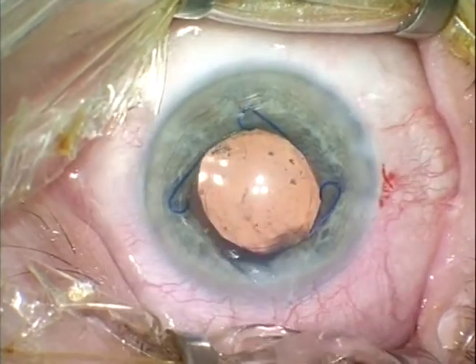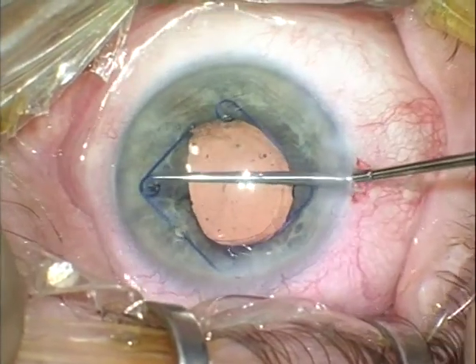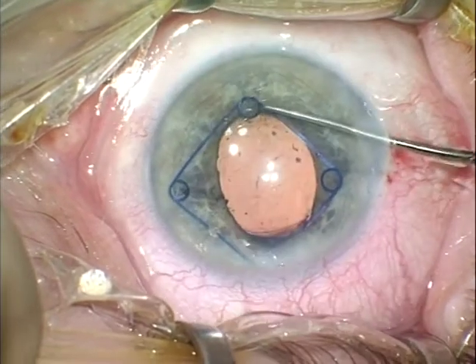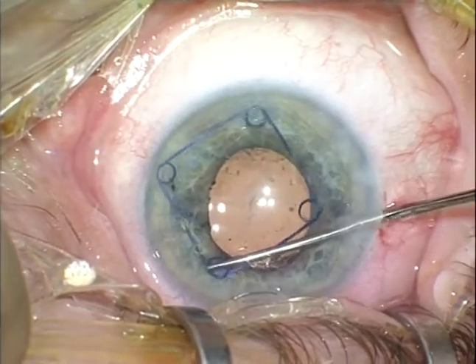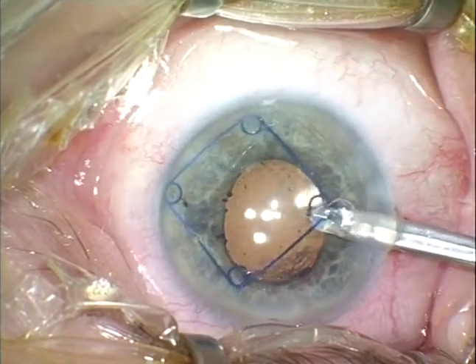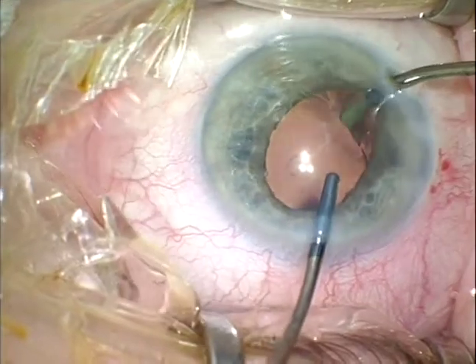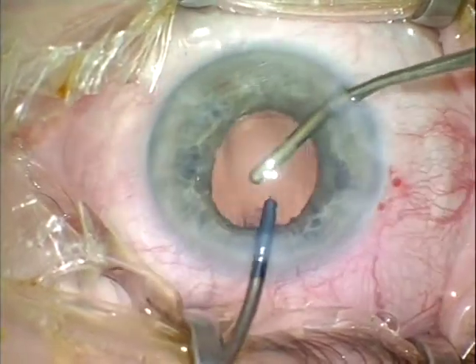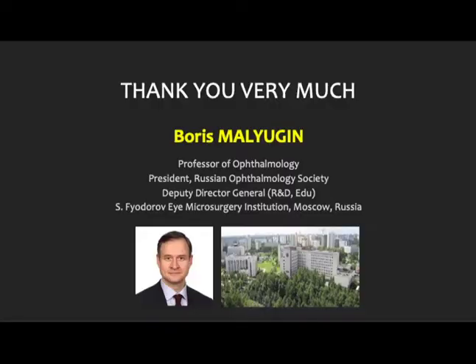Slight rotation may help me to assure that both haptics of the device are in place, and now I'm disengaging the scrolls, first contralateral, then located nearby the incision, and I will be releasing the last scroll right now, and will use the injection device to retract the Malugin ring inside the injector tube and remove it from the eye. After viscoelastic evacuation from the capsular bag and the anterior chamber, the case is completed, and I thank you very much for your kind attention.